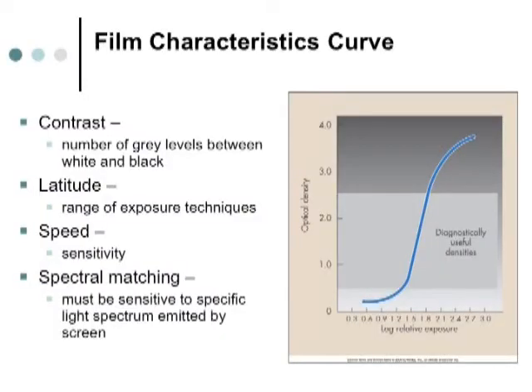So we run our films through processors. The longer the film's in the processor, usually the better the contrast will be. If we're doing mammography and still using films, we have 5-minute processors. By keeping the film in the developer long, it brings out the darker areas more and the clearer areas more and gives the film more contrast. Most departments use 90-second processors for normal X-ray.